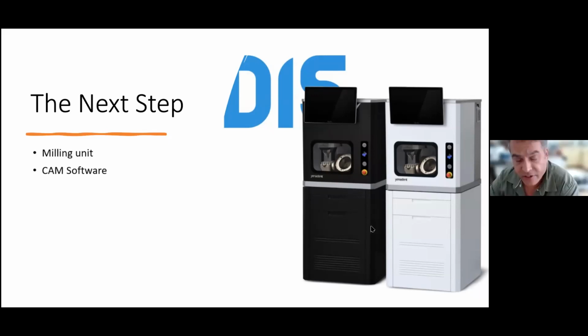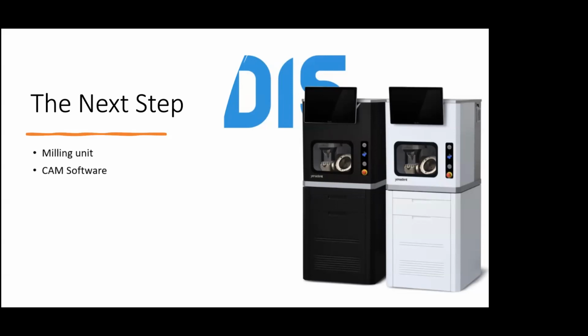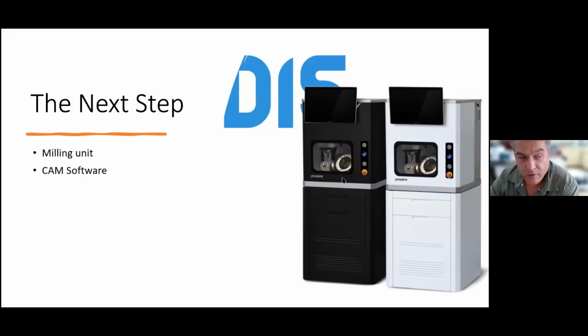I choose, for example, Imes machines because they are open. They are not bound to any manufacturer. I can put any STL file on there that I want to. I can use MicaCam, which comes with the machine, but if you want to use another CAM software, it's possible.